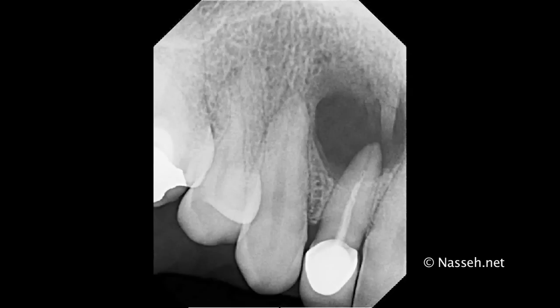As you can see, it's quite a large radiolucency. The borders are well defined, and usually when you see something of this size, you would expect that it would be a through-and-through lesion, which means that both the buccal and the palatal cortical plate is gone.